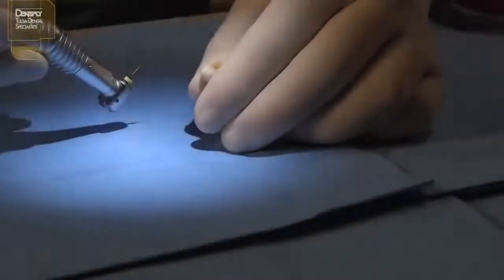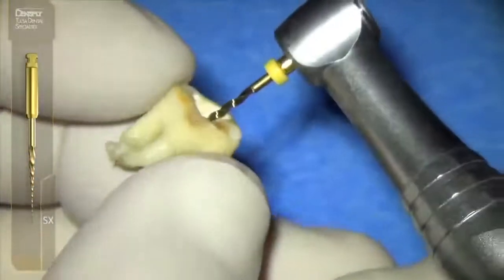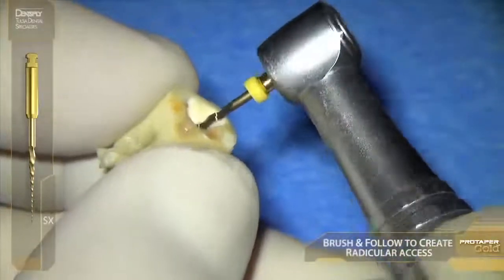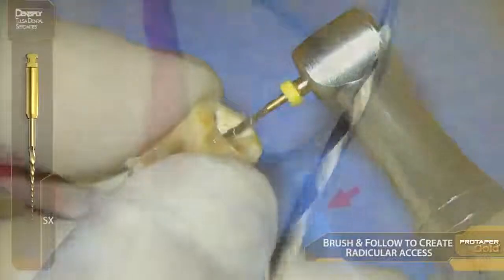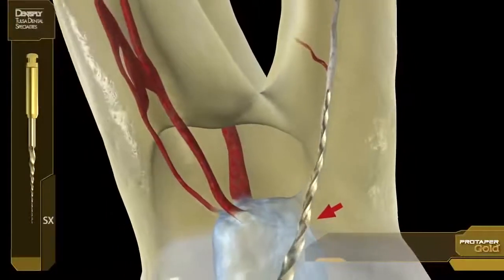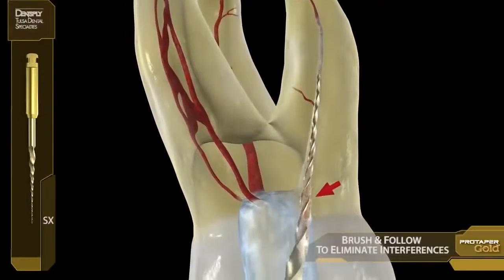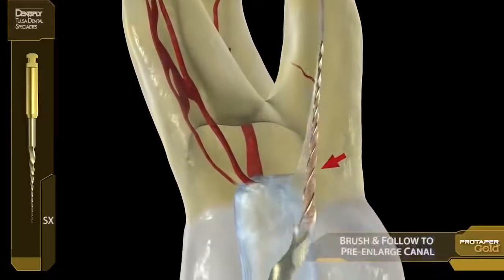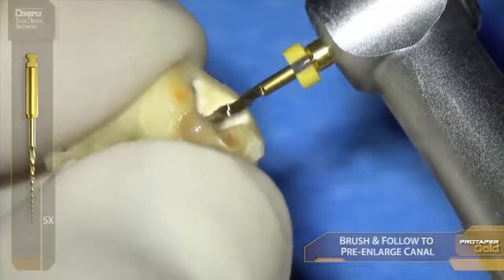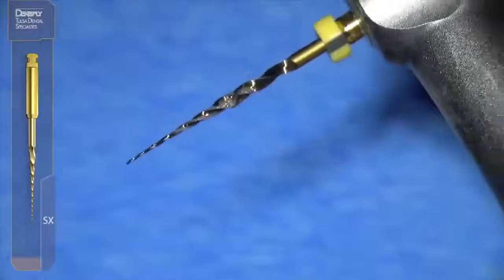We want to remove that triangle so that we have unfettered access into the distal buccal, and we can float, follow, and brush our way there with the SX — brush and follow, brush and follow, brush and follow.